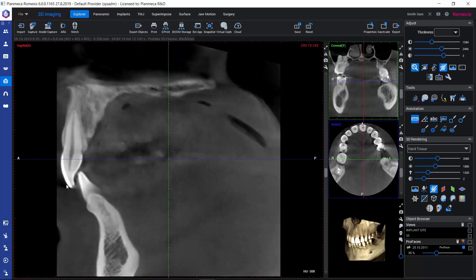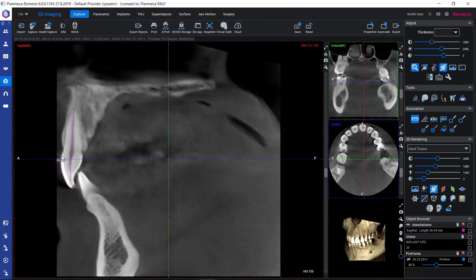3D images are calibrated by nature, so when we're making a measurement here by keeping our left mouse button down, we can rely on the measurement that is shown for us. The only thing we need to take care of is that we have adjusted the views so that we're actually measuring the right part of the anatomy.